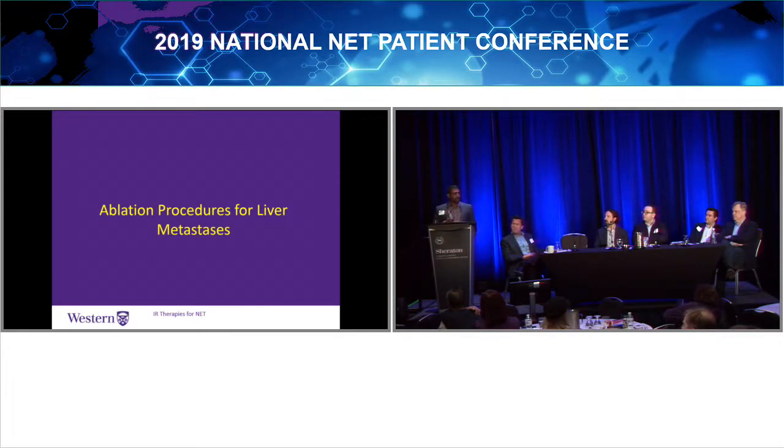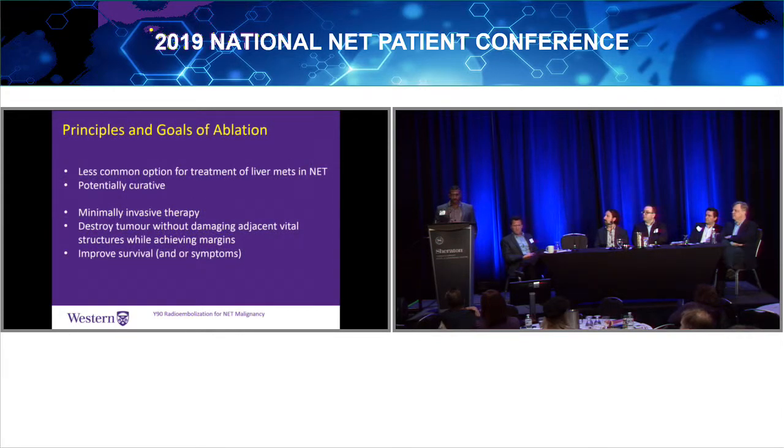Ablation is not something we commonly do, but I wouldn't say it's terribly uncommon in neuroendocrine, though it tends to be more the arterial therapies. It's a minimally invasive therapy. If we think about our goals of doing an ablation, we want to really destroy a tumor and have a margin much like what a surgeon would have, without destroying the vital tissues. And we also ideally would like to improve survival.